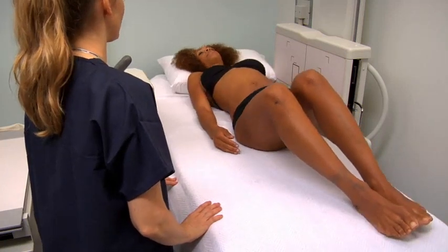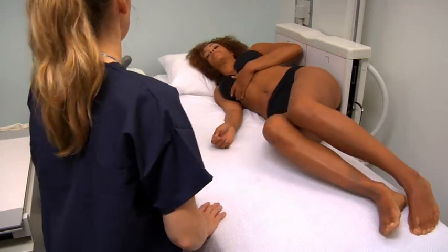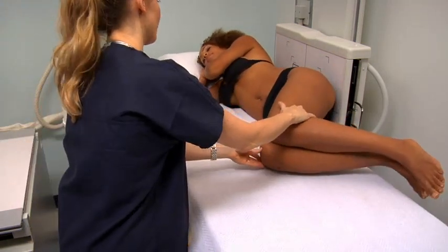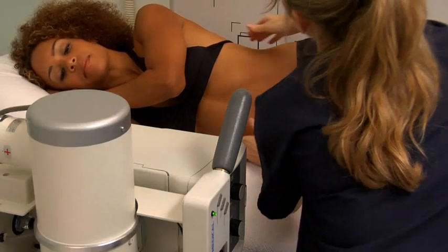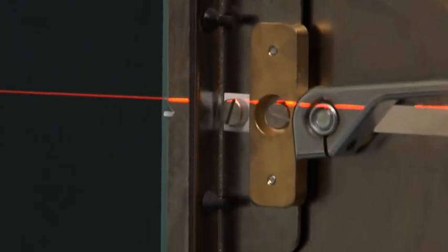These are described by the body part closest to the image receptor or by the surface on which the patient is lying. For example, a decubitus position in which the patient is lying down and the X-ray is projected horizontally toward the image receptor. The central ray is the part of the X-ray beam that has the least possible divergence and therefore the least distortion.